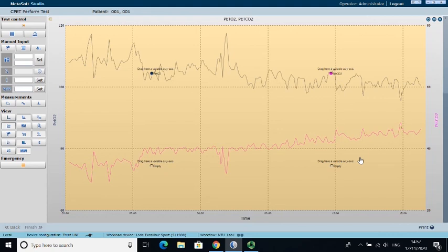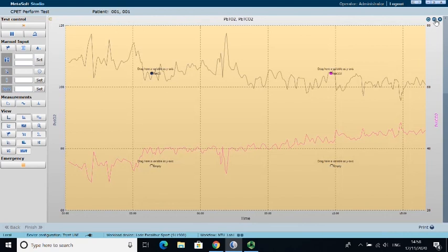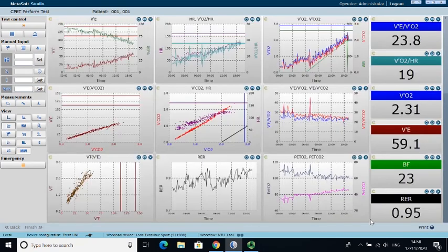Now I'm just showing you a plot here of these end-tidal oxygen, end-tidal CO2. The shape of the figures are not really important to you guys, so you'll see these variables crop up sometimes in the literature for heart failure and COPD. It's too complex to really go through what you're going to see in this short video, but essentially just understanding that it represents oxygen levels, if you like, oxygen pressures at the end of the breath. So when you're at maximum exhalation.